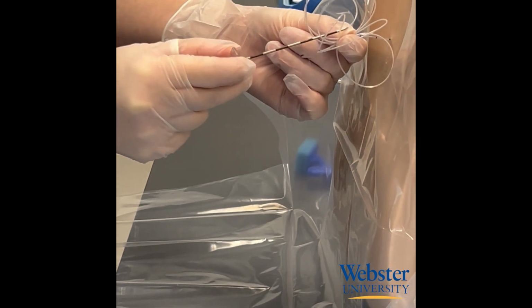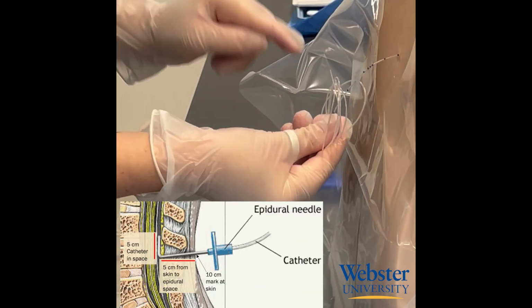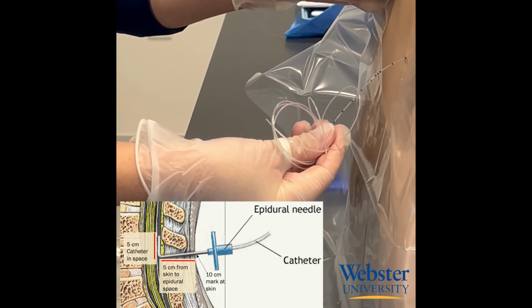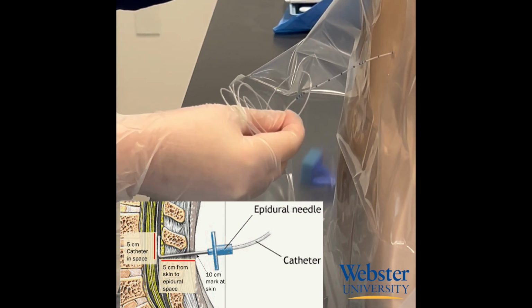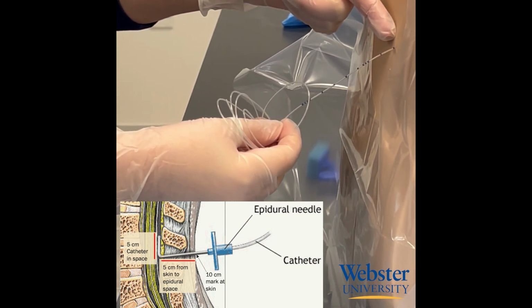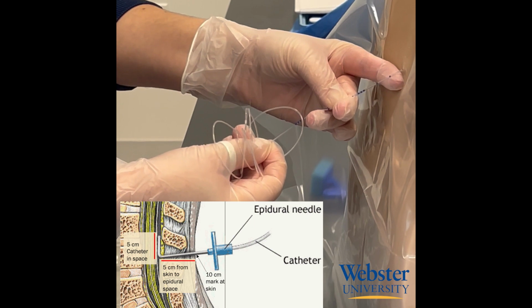Since it was 5 centimeters from the skin to the epidural space, the catheter should measure 10 centimeters at the skin, which is indicated by the 2 hash mark sign. That way I know there's 5 centimeters in the space and 5 centimeters in the skin. Right now I'm at 13, so I'm going to have to pull back a couple centimeters until I can see the 10 centimeter marking.